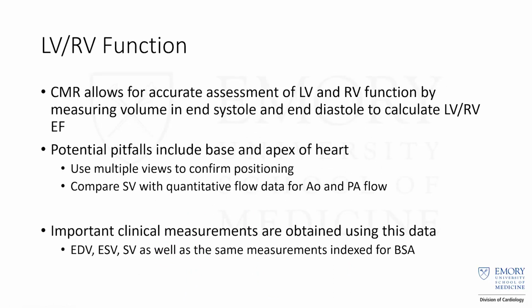One of the main functions of cardiac MR is for accurate assessment of the LV and RV function, and also ventricular volumes, both at end-systole and end-diastole. I'll show you how we do that in just a second.